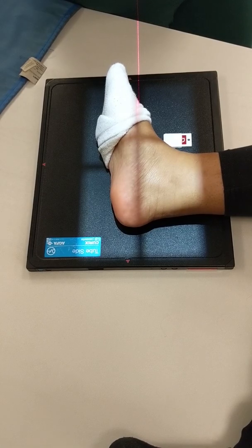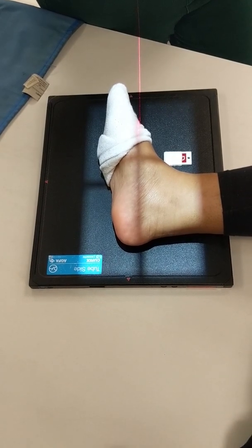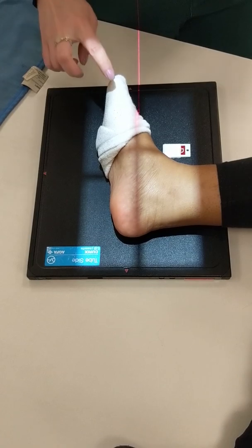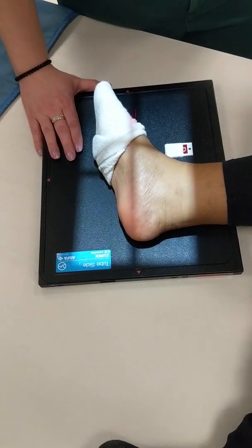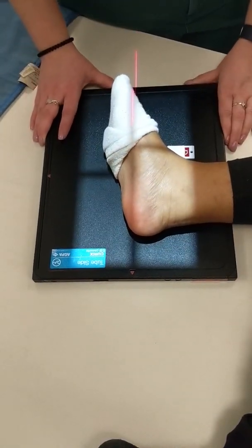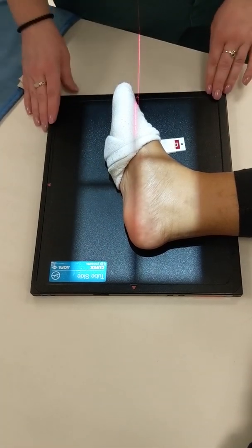Okay. And I'm going to leave my collimation open for just a second because what do I need to do? Line up my IR. So my CR and my part are aligned. So now I'm going to lift up just a tiny bit. Dorsiflex your foot for me. Centering it. There you go. Medial cuneiform. Okay, so centering and everything is good now.